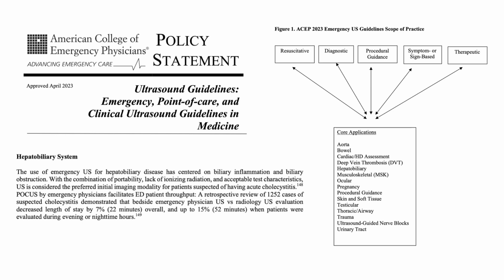There have been a couple of research studies that have come out in the last few years documenting how well we do compared to radiology. And we've been working on something like that here as well. So it's definitely a field that's grown. The credibility and acceptability of us doing ultrasound in the field of emergency medicine and surgery has definitely grown as well. So with that said, let's dive in and talk a little bit about the normal gallbladder.